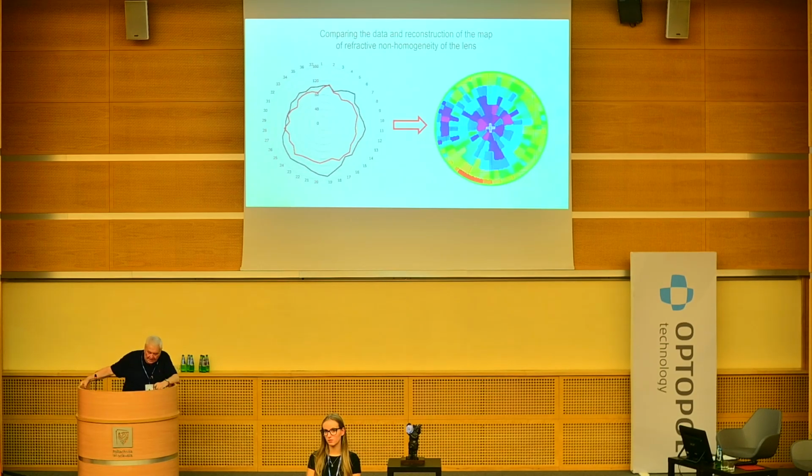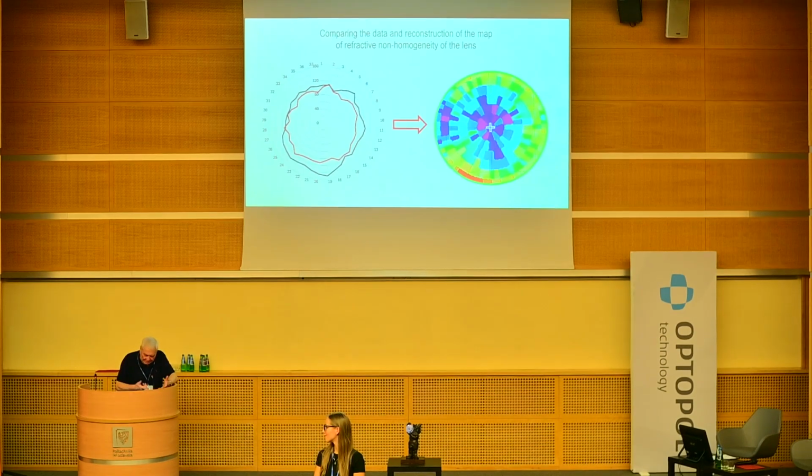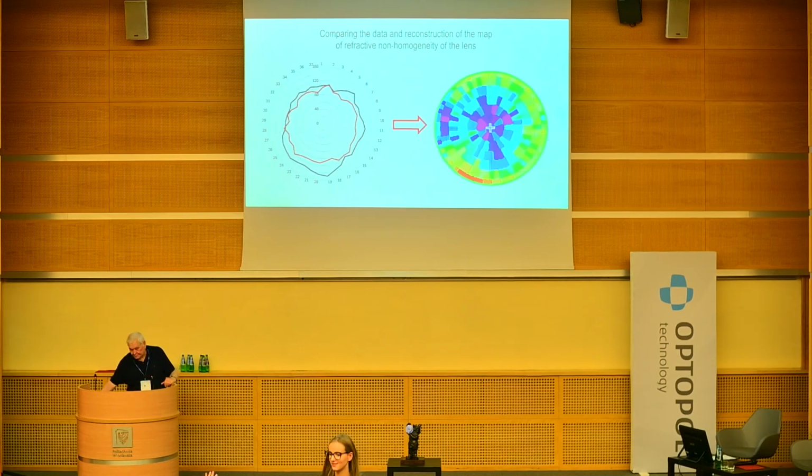And here you have the retinal spot diagram, which is in one of the softwares. It's not so important, but you see the trajectory of the beam on the retina, with the blue tilted one direction, the red tilted other direction. Okay, no more? Thank you.